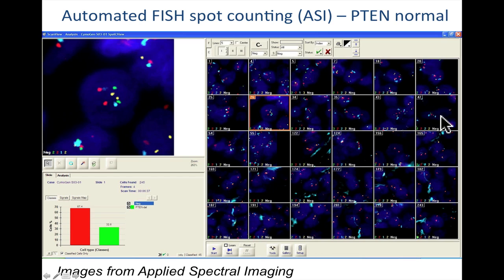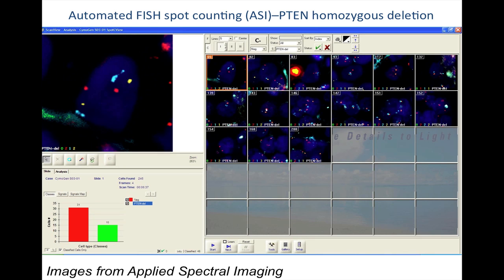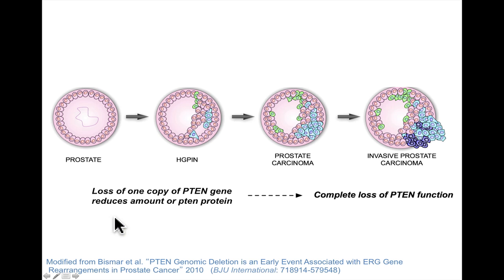At the moment, I think as one is developing the assay, it's best to have an experienced analyst score by eye and score on sheets. I think it's still not quite there for scanning, but it's not far off. And this is an example of a homozygous deletion detected using the scanning. So you can see PTEN is green, so you're seeing the flanking probes but losing the 2 green, and the counter goes through and spot counts.